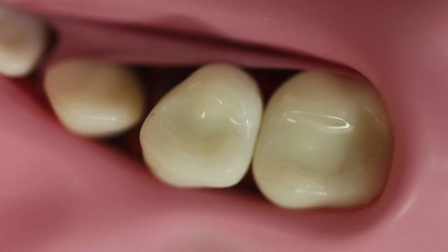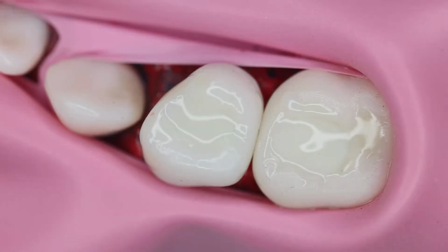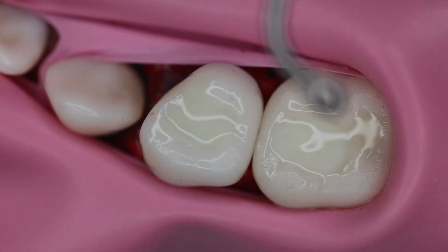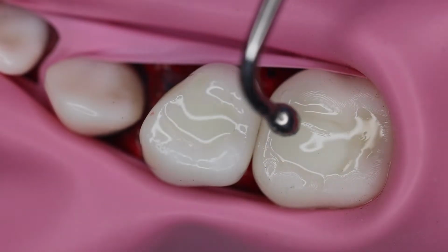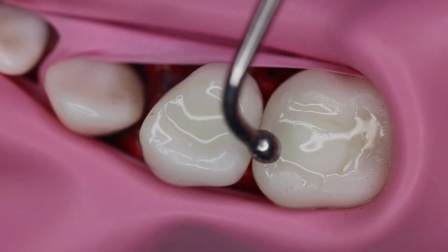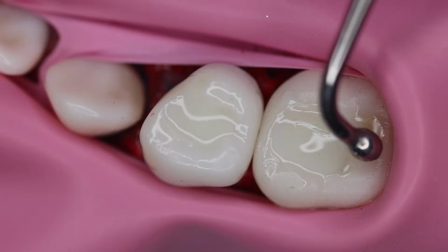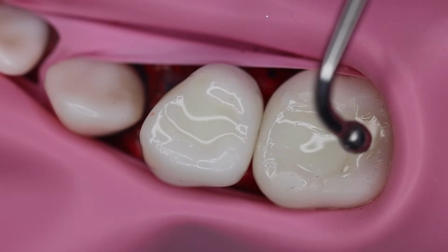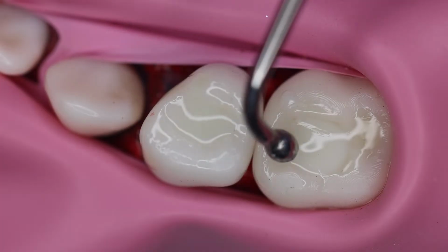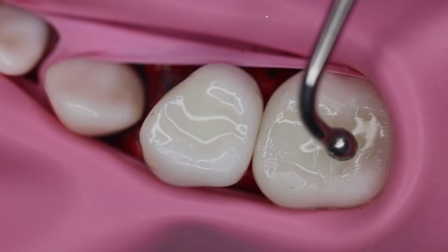Once done, this is how your restorative looks in the light when it is completely set. See how glossy the appearance is, and it has established its contours along the tooth. There are no elevated margins.